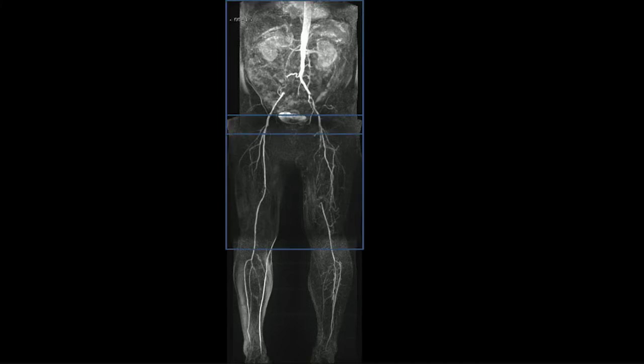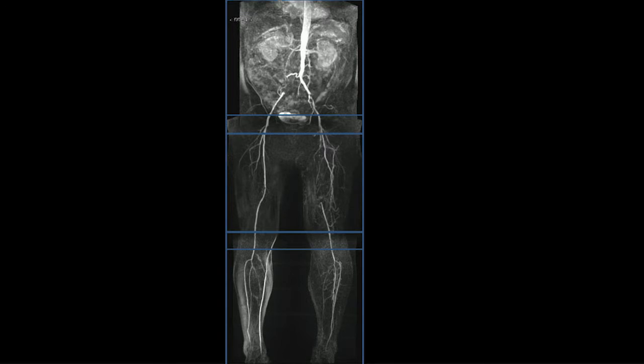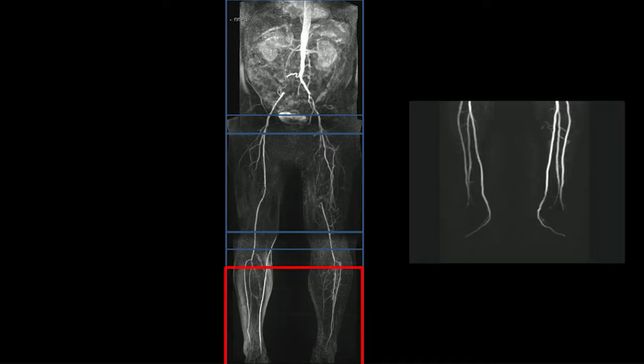Now, some people advocate using standard 3 stations and using the same coverage for your tibial station for your time-resolved imaging. I don't do that. I don't advocate doing that at all, and I would strongly suggest, if at all possible, to center your time-resolved acquisition as low as you can get it to try and get good detail of the plantar arch.